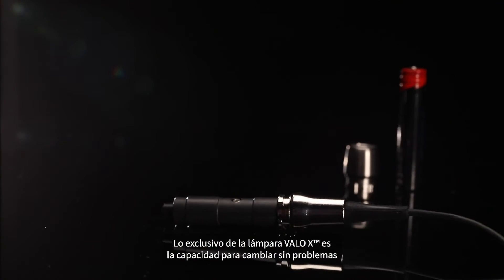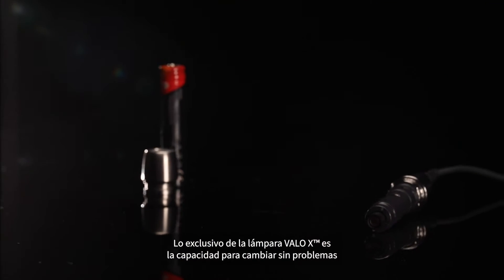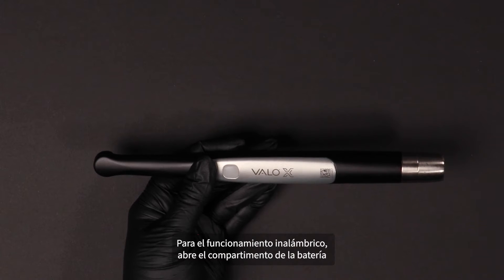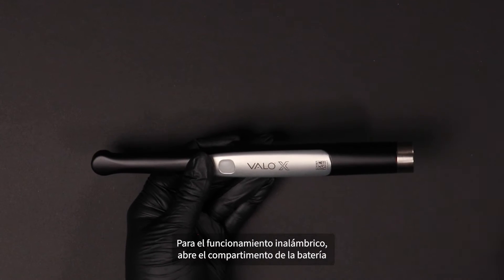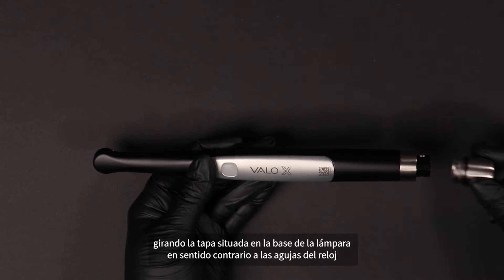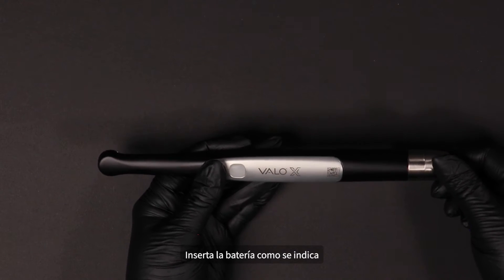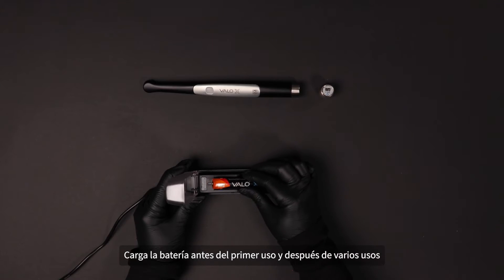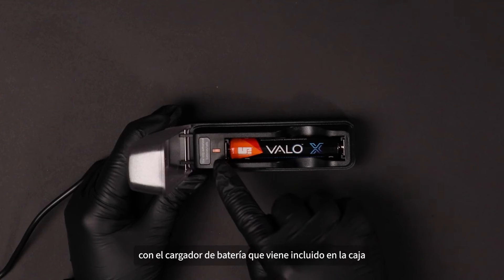Unique to the VALO X light is the ability to seamlessly switch from corded to cordless battery operation. For cordless operation, open the battery compartment by turning the cap at the base of the curing light counterclockwise. Insert the battery as indicated. Charge the battery before first use and between uses with the included battery charger.